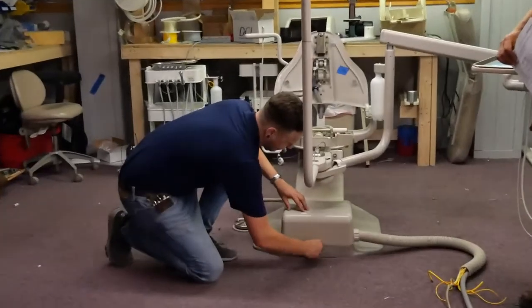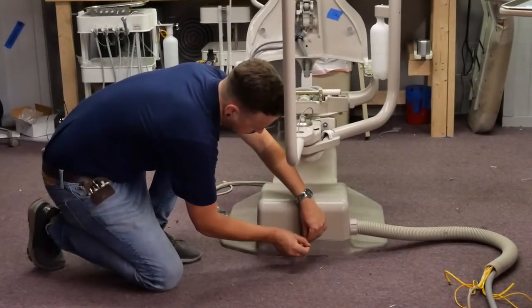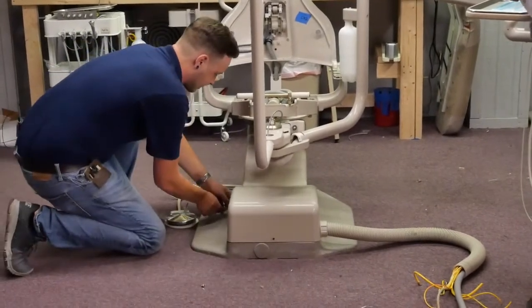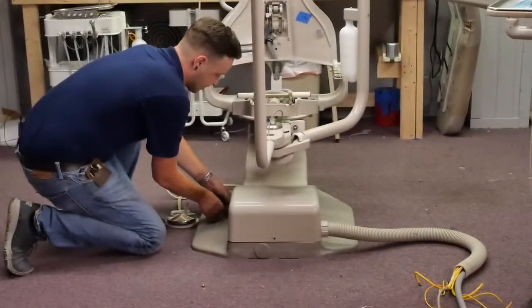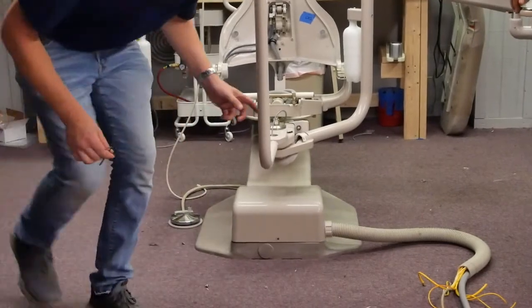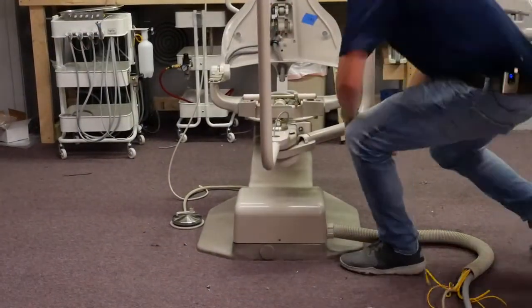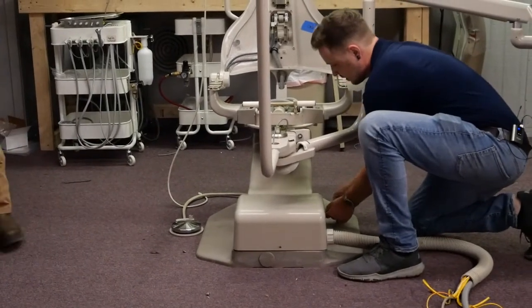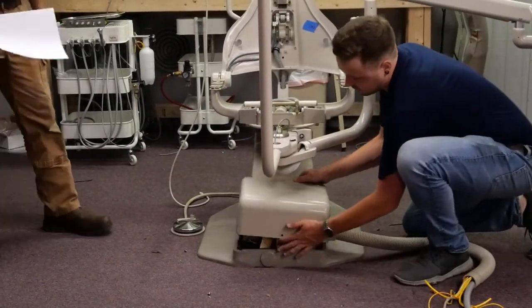One in the front, and then one on each side. And then once you get these off, it reveals all of the components.